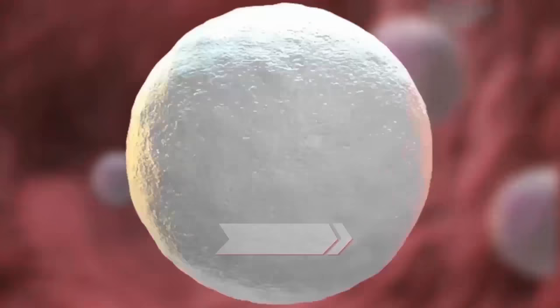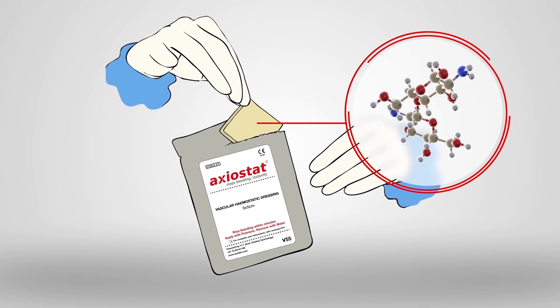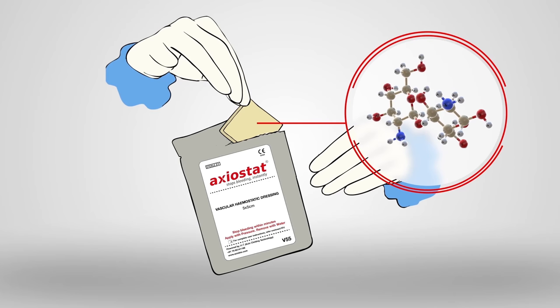Blood clotting is a complex process that involves several factors and pathways. Exeostat, which is made of 100% chitosan, helps speed up this process and achieves hemostasis in a considerably shorter period of time.